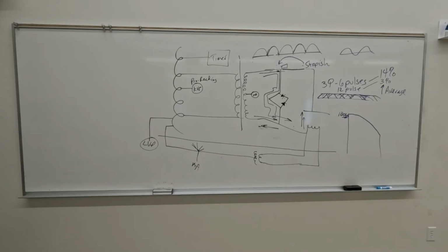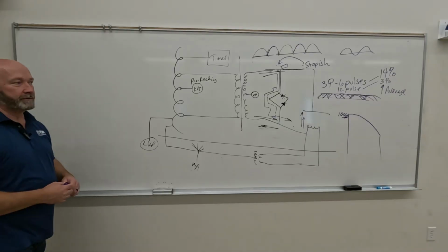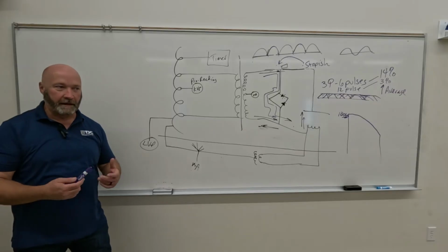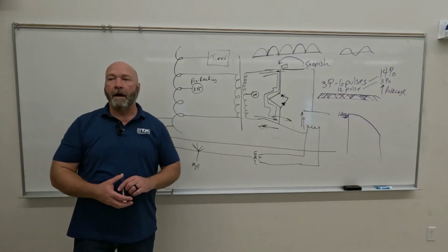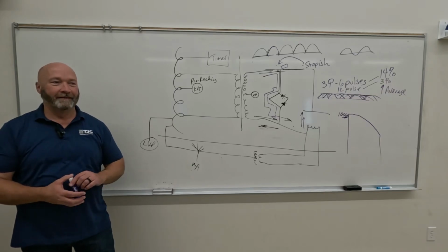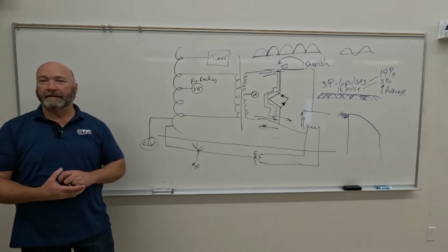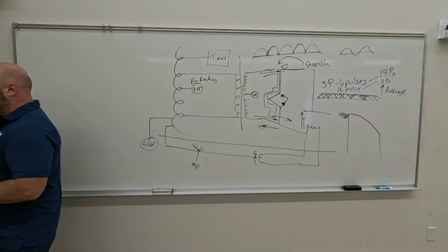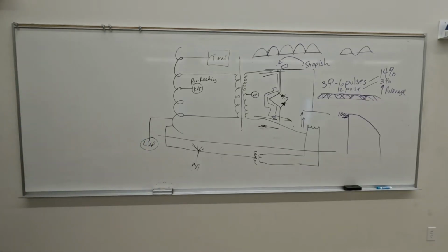Power rating is really the only thing that we've got left. So power, we're dealing with electricity, and what's electric power? How do we calculate electric power? It's measured in watts, right? And that is voltage times amperage. So power rating in our X-ray unit is just that. It's amps times volts, but it's going to be very specific.